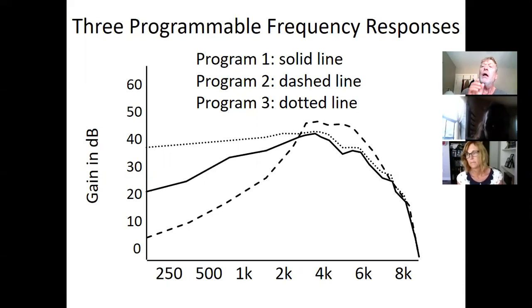Okay. A third program might be music. Now think about music. When we studied this course and when we studied sounds, what are low frequency sounds? Mostly that's music. What's 125 on your audiogram? Low C on a piano. What's 250 on an audiogram? Middle C on a piano. What's high C? 500 hertz. All of those frequencies are on the low frequency half of the audiogram.